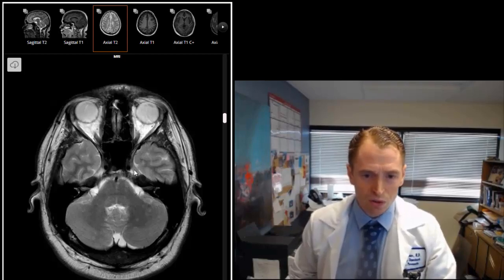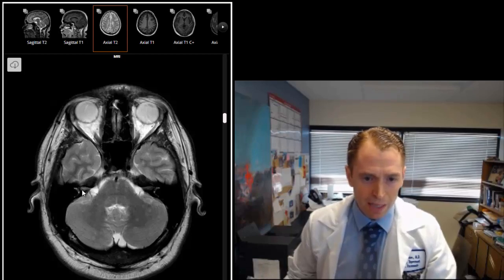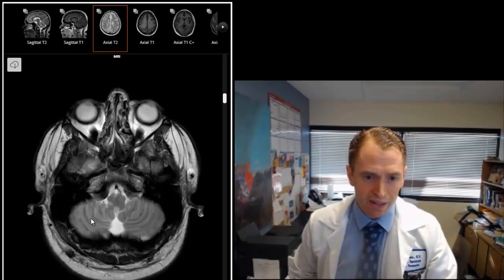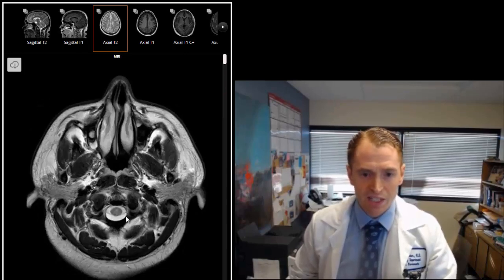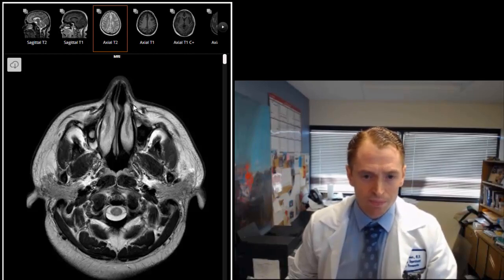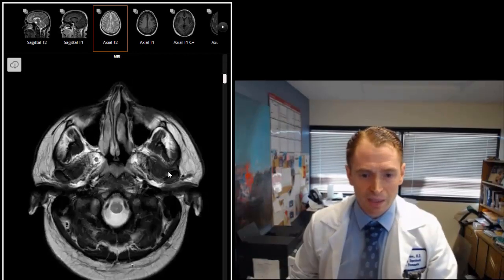These are the temporal lobes of the brain. This is the middle ear and you can sort of see the semicircular canals that control balance. This is the brain stem, this is the pons and the cerebellum, and this is the parotid gland, one of the salivary glands. We're very low here so this is sort of the top of the spinal cord. This is the nose and nasal septum, and you can see there's a little bit of a deviated nasal septum which is very common.